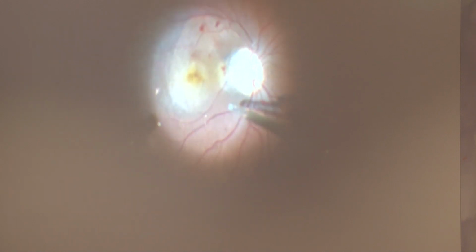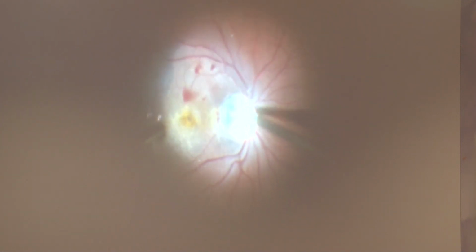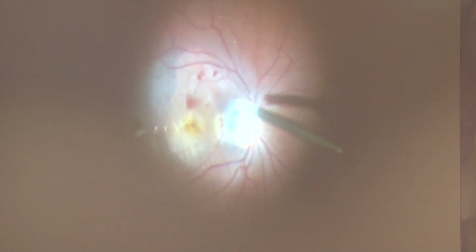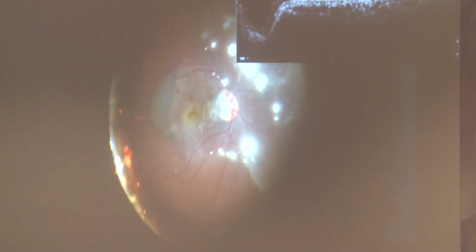The free ILM from the temporal side of the macula was stuffed in the optic disc pit, covered by the ILM flap, and then PFCL was put. Fluid air exchange was done, followed by substitution of air with 16% SF6 gas. Post-op BCVA after 6 weeks was 6/24 with significant reduction in subretinal fluid, and the patient was fairly happy.